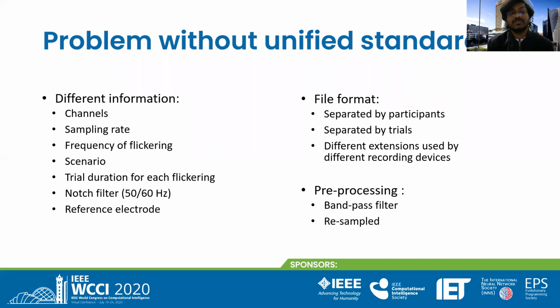even if we want to improve the performance, there's a lot of work that needs to be done. First is to make the datasets openly available for researchers like you in a unified standard format, so that you can develop one single interface in your code and read the data, and focus more on your algorithm to improve the performance, rather than processing the data from one format to another, digging out different information from the data, and only then spending some time on your machine learning.